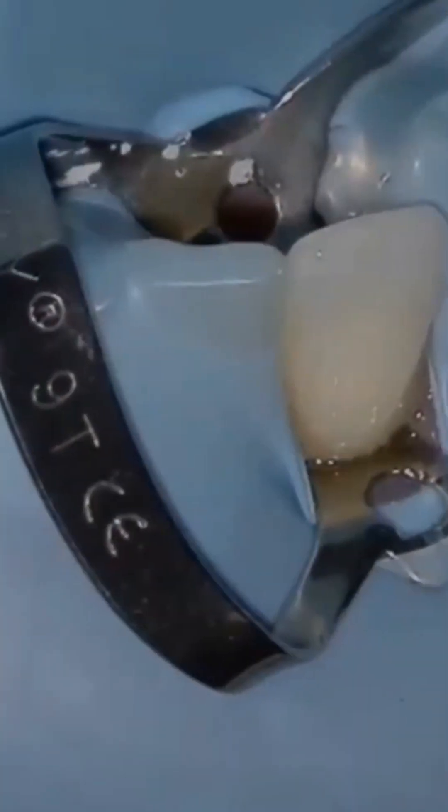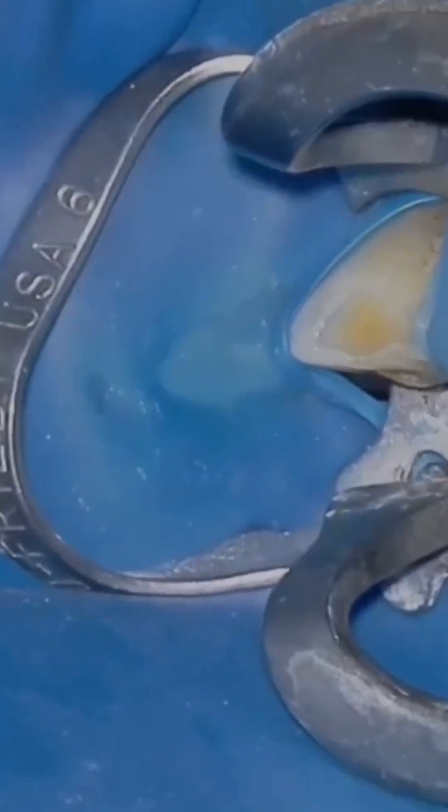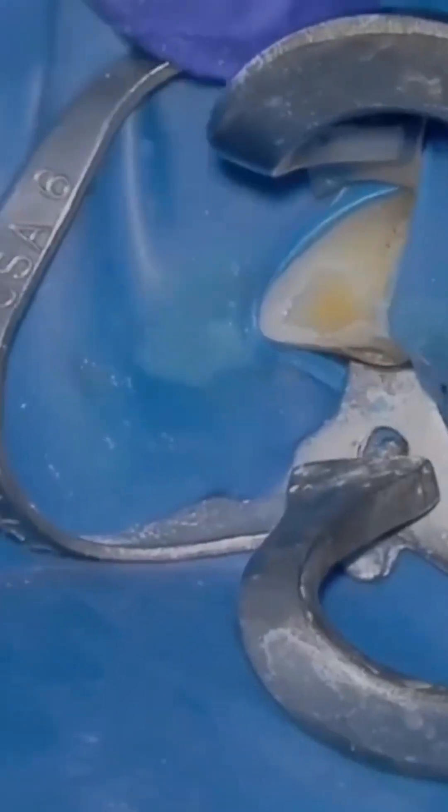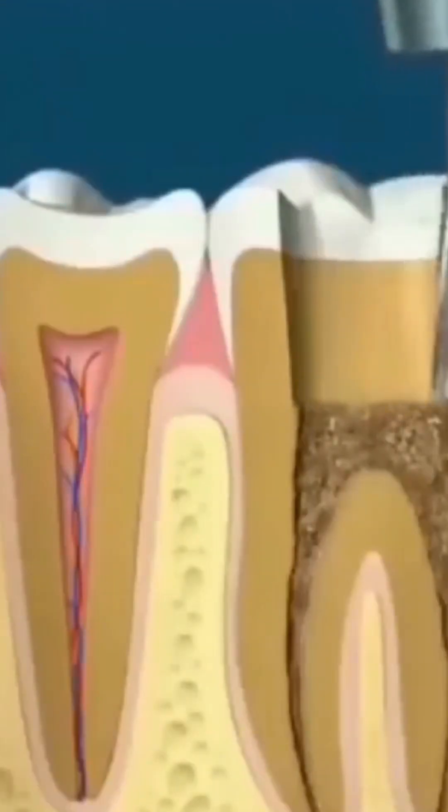They place a dam around the tooth to isolate the area. Then they may apply a dental sealant, which seals around the tooth.